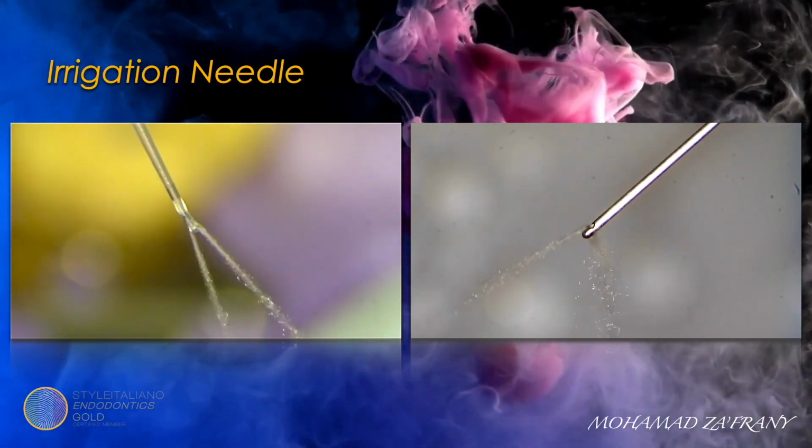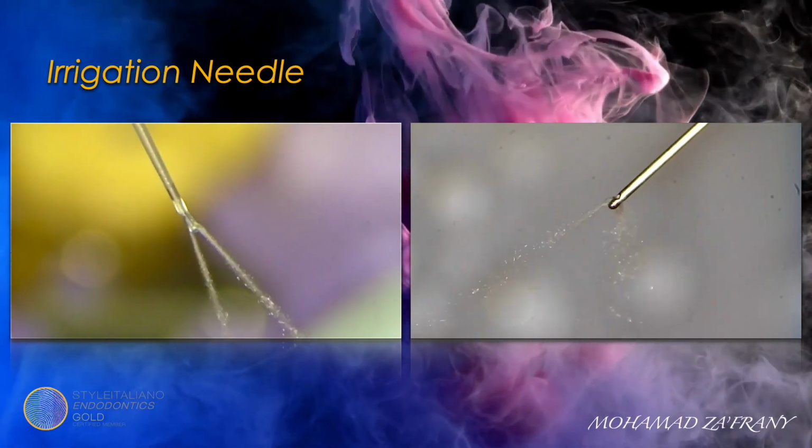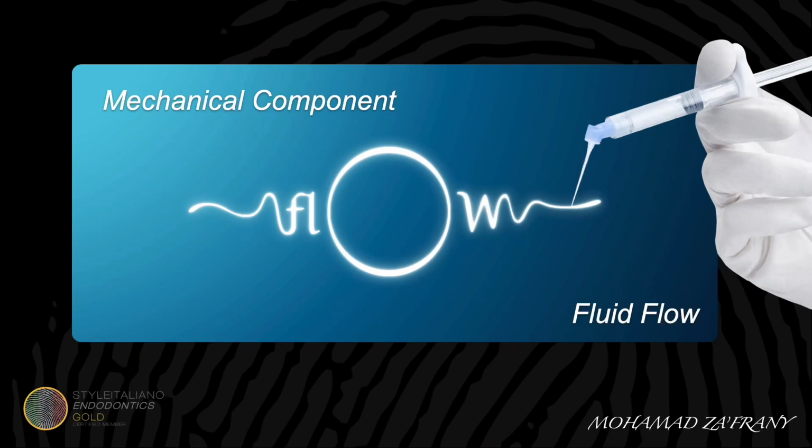Before speaking about a protocol for disinfection, let me highlight more the importance of the quality of the irrigation needle. We know that it's mandatory to use a side-vented needle, but did you think about how important the flow of the fluid from the needle is? The fluid flow is the mechanical component of irrigation and the fluid dynamics.